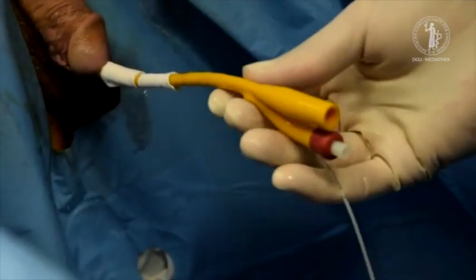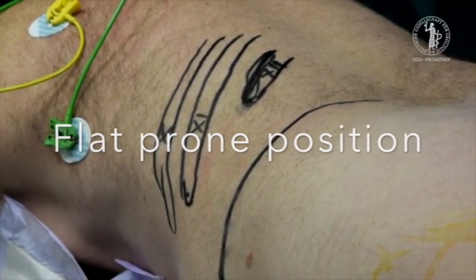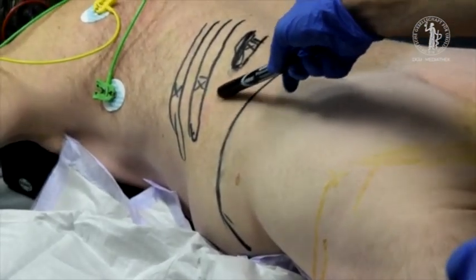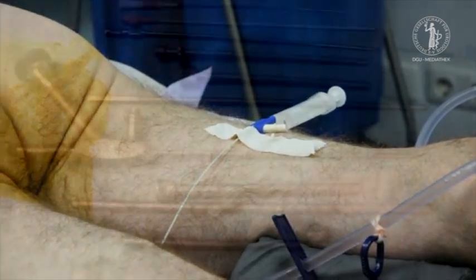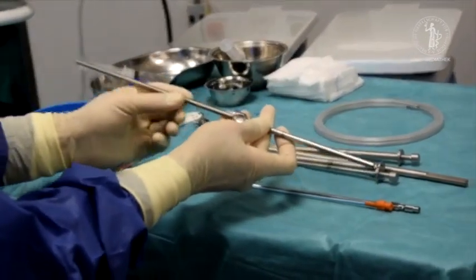The ureteral catheter is connected to a Foley catheter and the patient is now turned into a flat prone position. The desired puncture area is limited by the ribs and the pelvic rim. We are using the MIP set from Karl Storz that consists of several sizes of sheath dilators and nephroscopes. The M system was selected for this case.